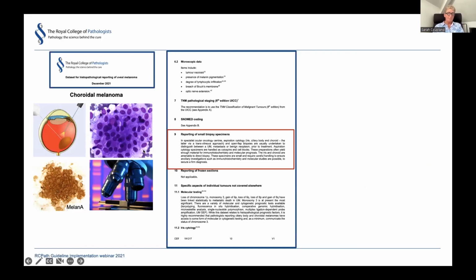If we're still unclear that this is a melanoma, then we undertake the immunocytology. If, however, from the morphology it represents a classic melanoma, then we spare the cells and use them for DNA extraction to undertake the molecular studies, which are required for the prognostication in the patients who have consented for that.